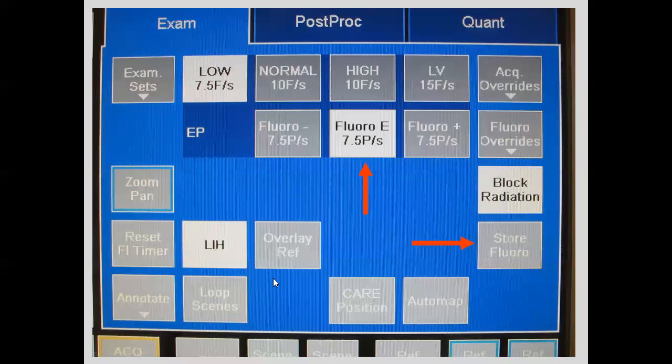Okay, so that's the other thing. When you walk into the lab and you start doing fluoroscopy, you should know on the controls how to adjust your dose rates, okay? On our Siemens, it's literally easy. It's just a touch panel right alongside. You just touch each one of these buttons. We got our lowest, it used to be defaulted here. Now it's defaulted to our fluoro minus, and then fluoro plus, so it's literally a button push. And if you do want to go up to 15 frames, it's 2 button pushes. So it's very easy, and there's no reason not to.